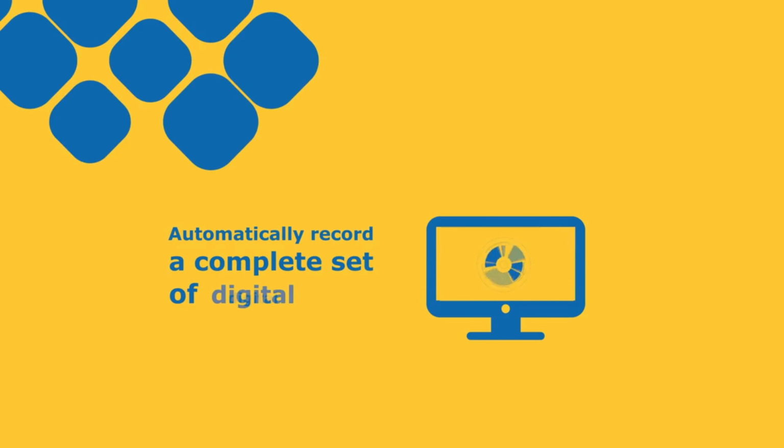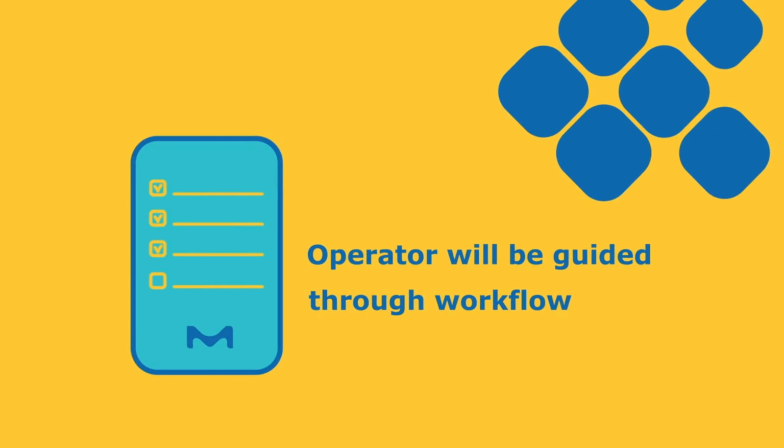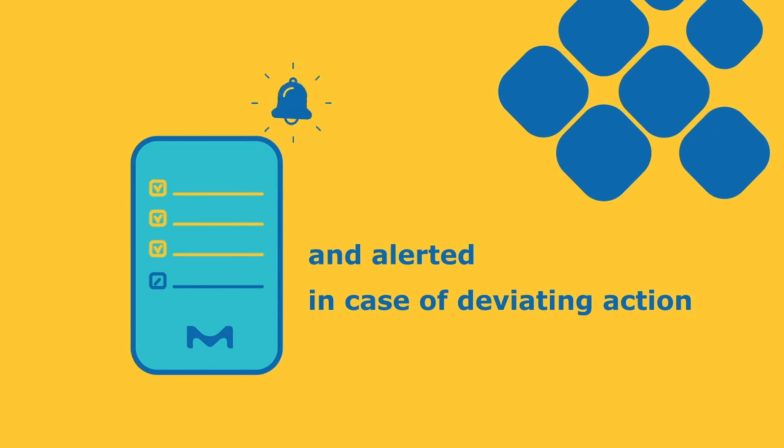Automatically record a complete set of digital data for each test. This ensures full traceability and regulatory compliance, with all data recorded contemporaneously. The operator is guided through the workflow and alerted in case of deviations. This reduces the risk of human error and increases process safety.